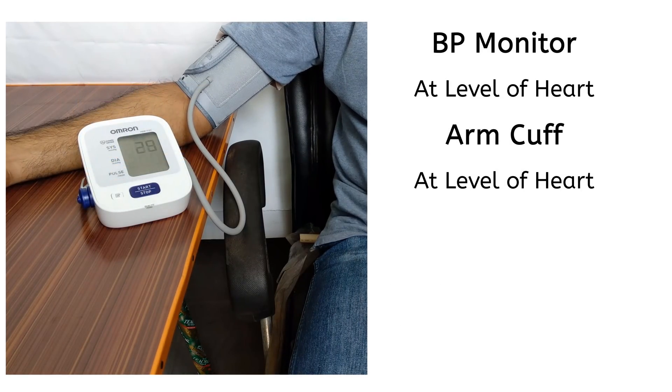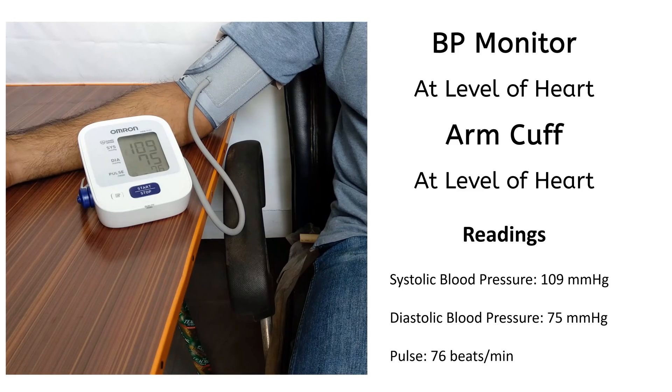This position is with both BP monitor and arm cuff above the level of heart. These are the readings on the monitor.